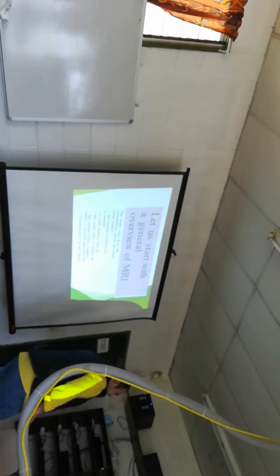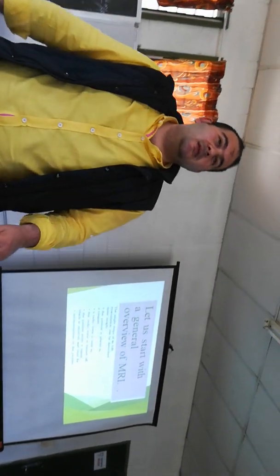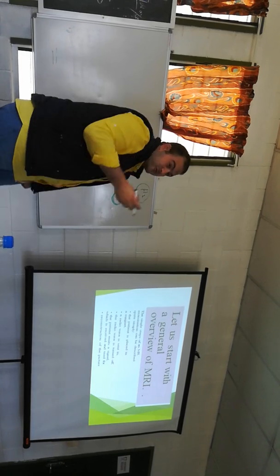That the radio wave, when the patient is placed inside our magnet, what happens to the patient? You will find that around 70% of the patient's content is water. Our body is composed of water, okay? Water contains hydrogen. So this hydrogen is like a positive charge. This proton, hydrogen, okay? You will find inside the nucleus a proton.